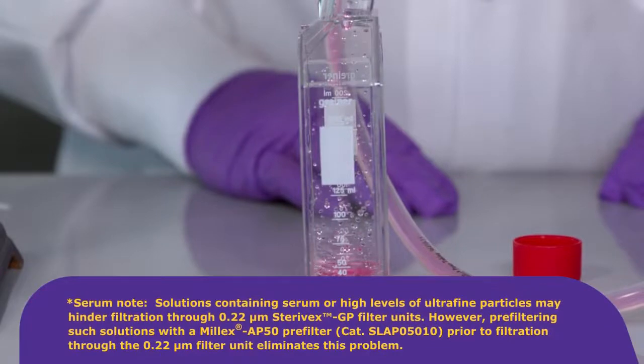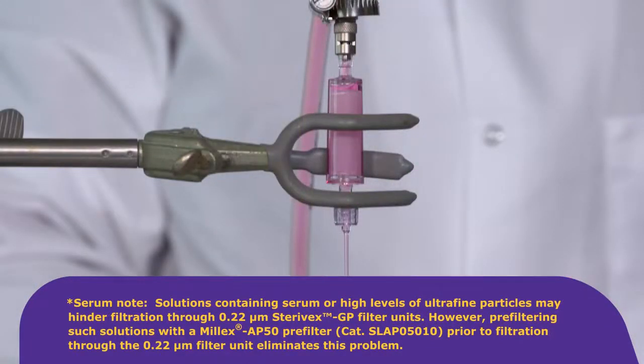Serum note. Solutions containing serum or high levels of ultrafine particles may hinder filtration through a 0.22 micron Sterivex GP filter units. However, pre-filtering such solutions with a Millex AP50 pre-filter prior to filtration through the 0.22 micron filter unit eliminates this problem.